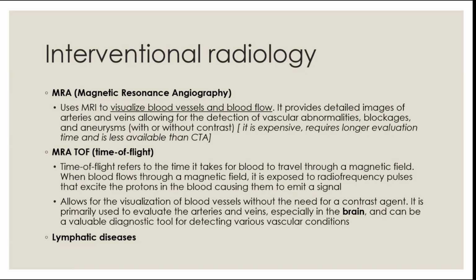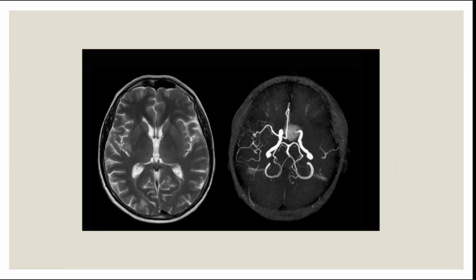You can also evaluate lymphatic diseases. Of course, you have ultrasound, but you can also use MRI.